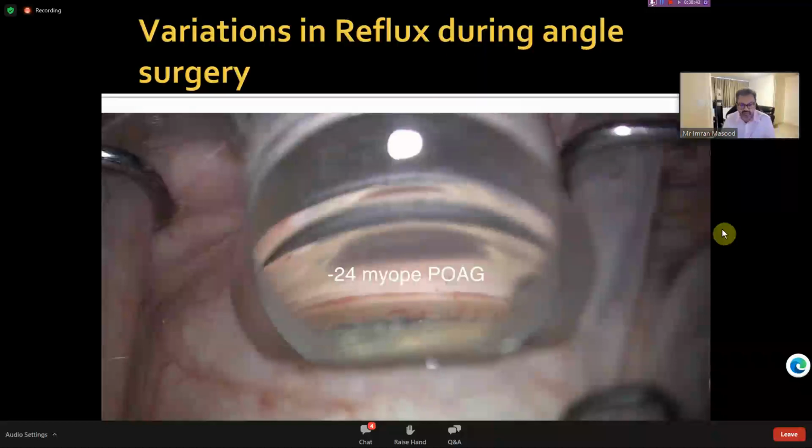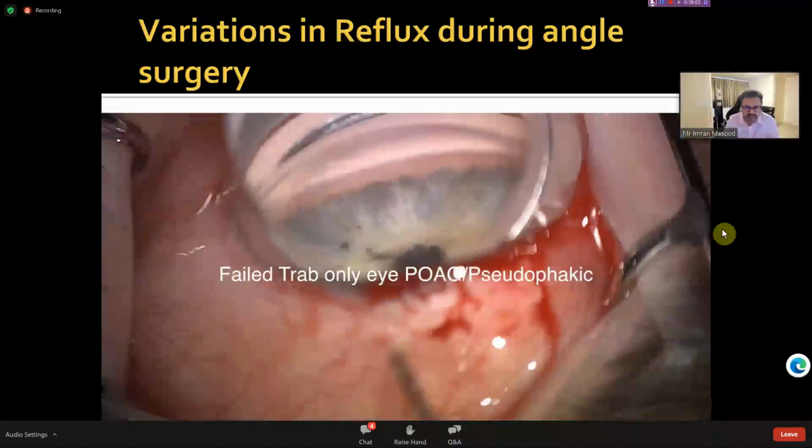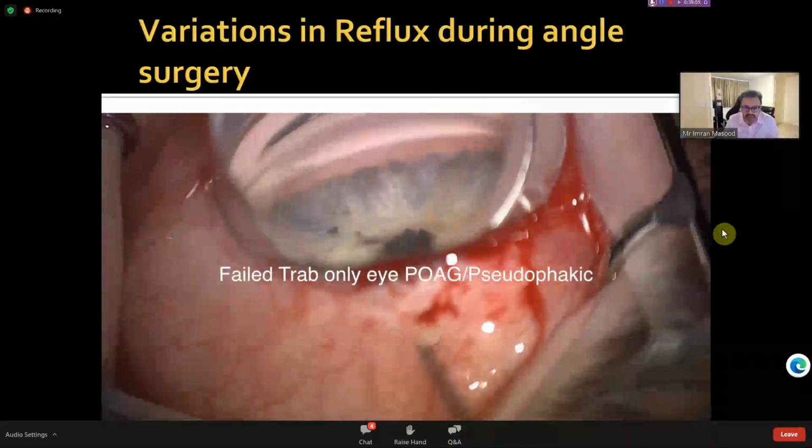So if we carry on, this is actually the G1 stent. This is someone with a very thin bloodline. This is a patient with more of a juvenile type of glaucoma with a background of retinitis pigmentosa. And you can see that the Schlemm's canal or the trabecular meshwork height is much, much smaller. That's, again, what Professor Shah was talking about. I'll just carry on to the next one here.